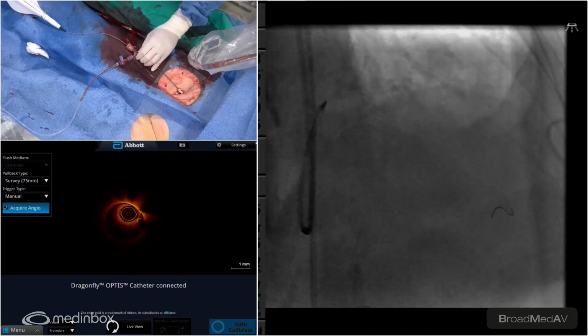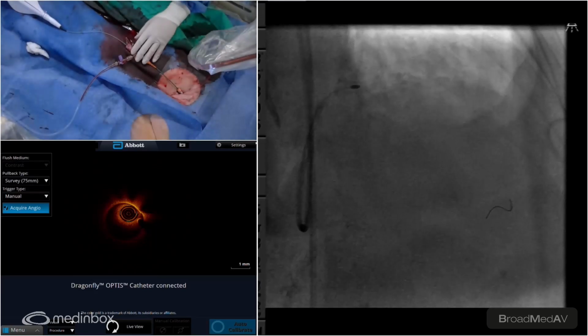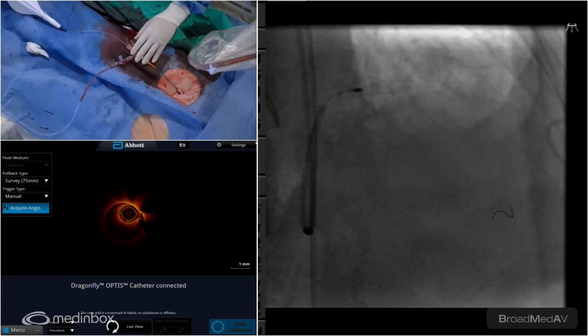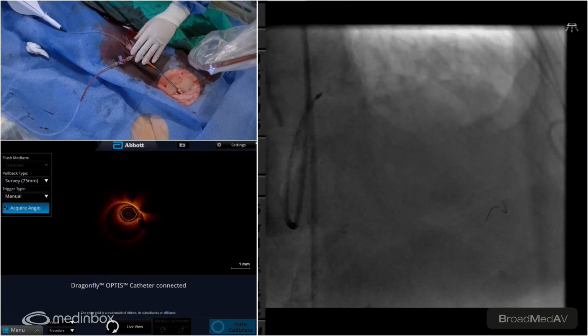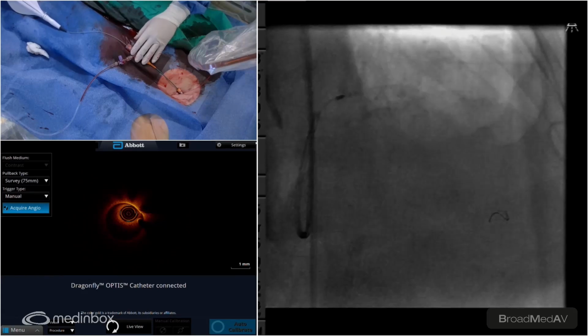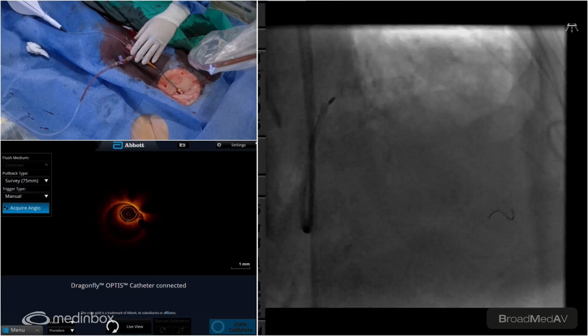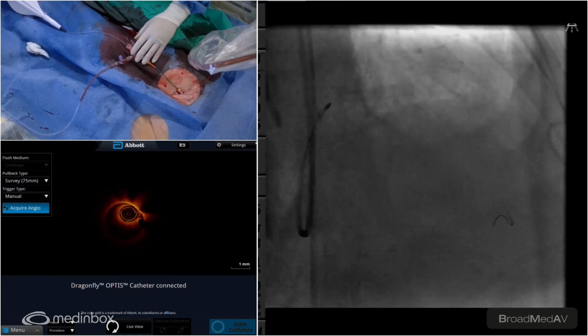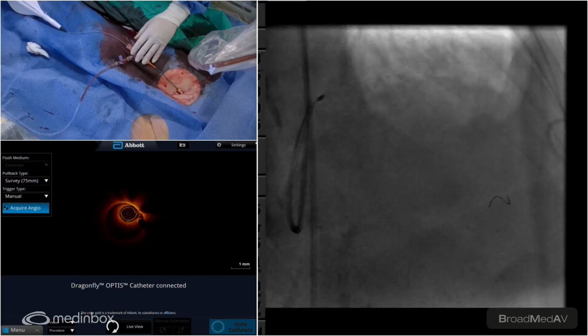So obviously, as it's doing that, we're looking for decels. Anything more than 5,000 tells us that you're generating some heat and opening yourself up to thrombosis. So far, we're dropping to 150s, so you're ablating nicely. Okay. Just tolerate it pretty good. Very little decel there. That was beautiful. That's how to do it. You don't want to rush it.